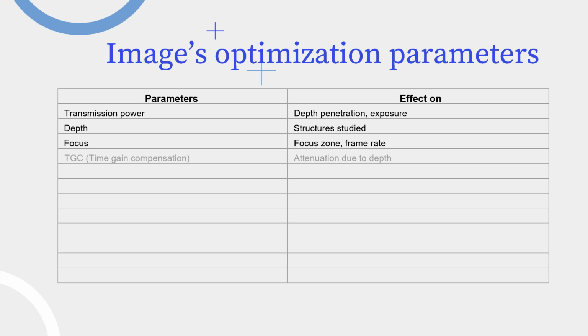the frame rate. TGC means time gain compensation, and it's a gain applied only to deep echoes, as they are weaker than echoes from superficial structures. This gain will vary with transducer frequency, organ or system being imaged, and body habitus type being imaged.